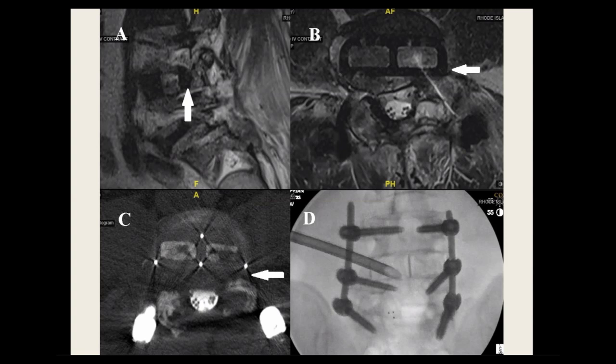I couldn't agree more. And I think another important point is if you look at frame D, the tubular retractor, with the way the bevel is, it's a tool that you can use to protect the dura or the traversing root or the exiting root if you need to while you're using that high-speed drill. So your neural structures are completely protected while you do your work. And I think that's a point that isn't truly understood by a lot of people who don't do endoscopic spine surgery. I couldn't agree more. I think understanding that the tubular retractor really acts to retract the dura so we can safely access pathology is one of the keys to the procedure.